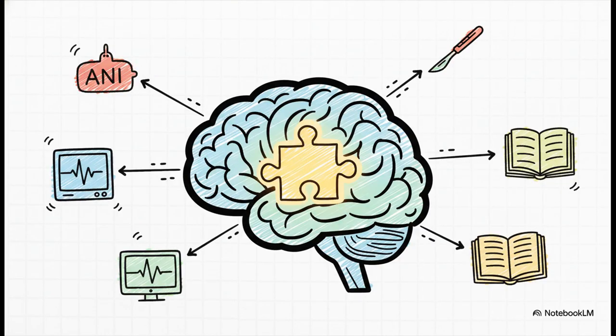And I can't stress this enough. This is a tool. It's an amazing new data point, but it does not replace you. It doesn't replace your brain or your clinical judgment. You have to take that number and put it in the context of everything else that's going on. The hemodynamics, the anesthetic depth, what the surgeon is doing, and your own experience.